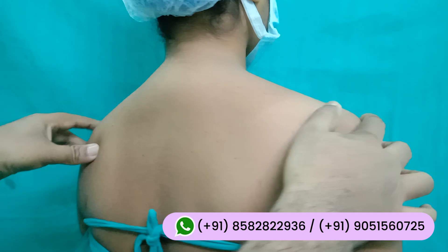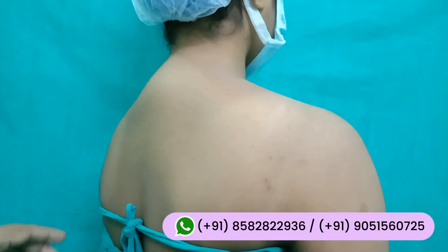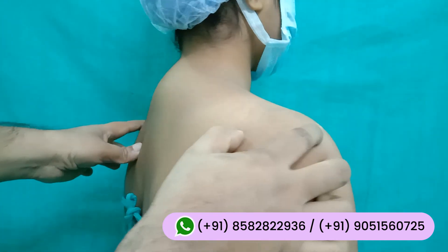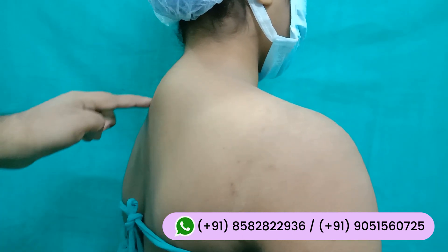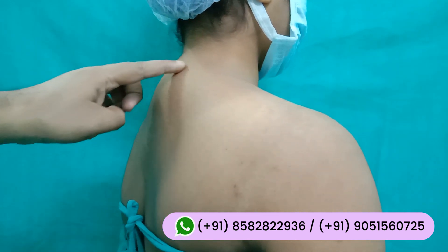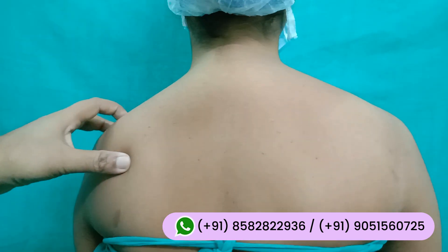Welcome! Today we are going to do a cosmetic surgery. This is the female patient. We are going to do a little bit of a buffalo hump — we are going to do liposuction. So friends, this is called buffalo hump, and we will be doing liposuction for this condition.